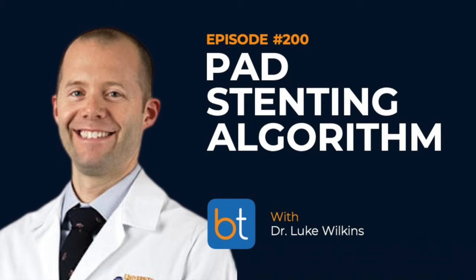I don't get that. To me, I think you kind of need both to make an informed decision and to really see what kind of efficacy the treatment that you've given has provided. But that being said, I usually use it when I see something that I am uncertain on the angiogram. So if you think, oh, that looks like there's a little bit of narrowing in there and it's uncertain on a secondary view, or you just see that the contrast is slightly lighter and maybe you're just seeing a lesion on fluoroscopy, then I think it's worthwhile doing the IVUS as a decision-making point and a way to decide if you need to do something additional.